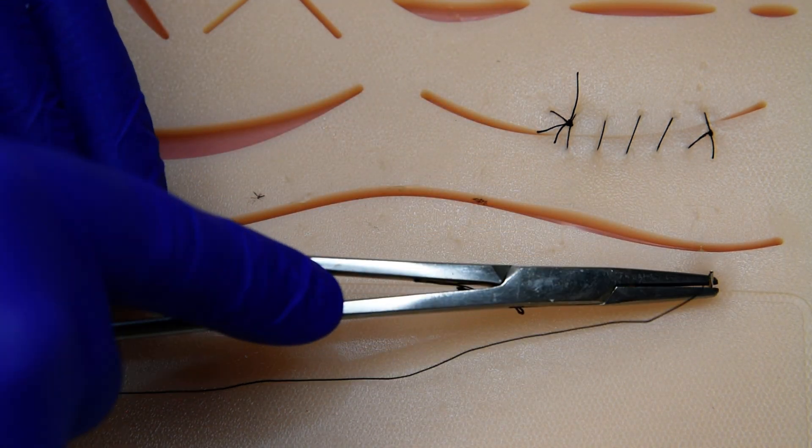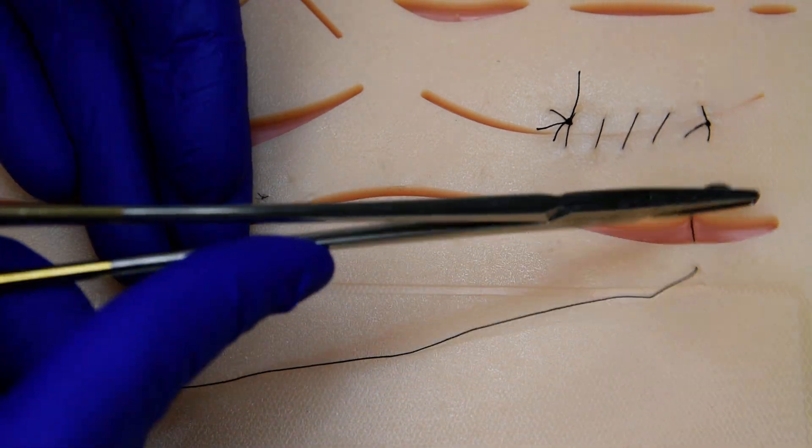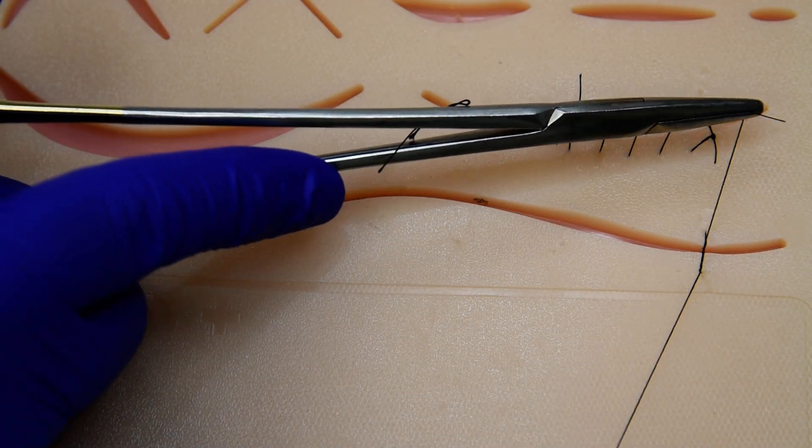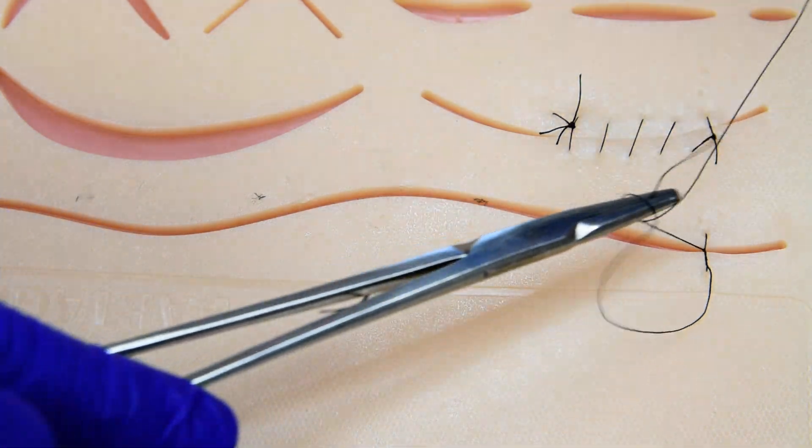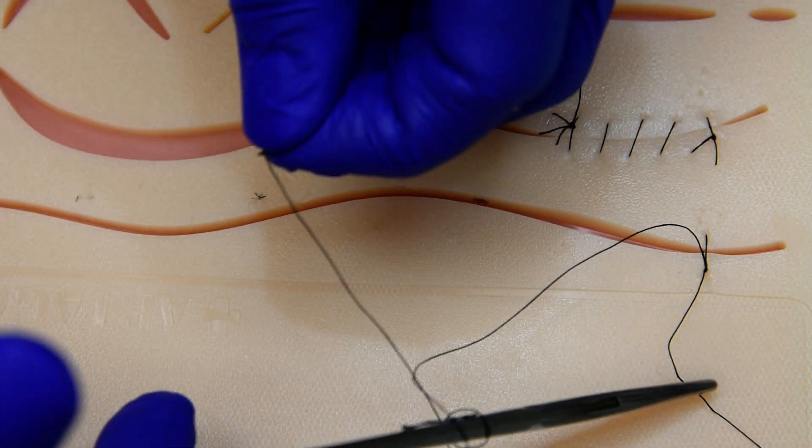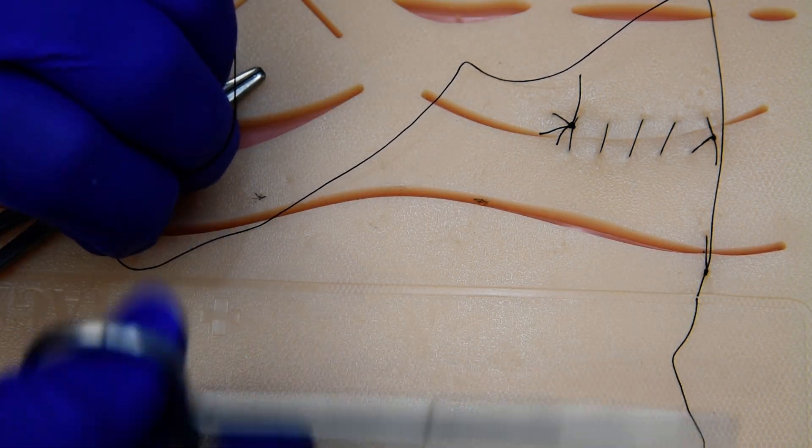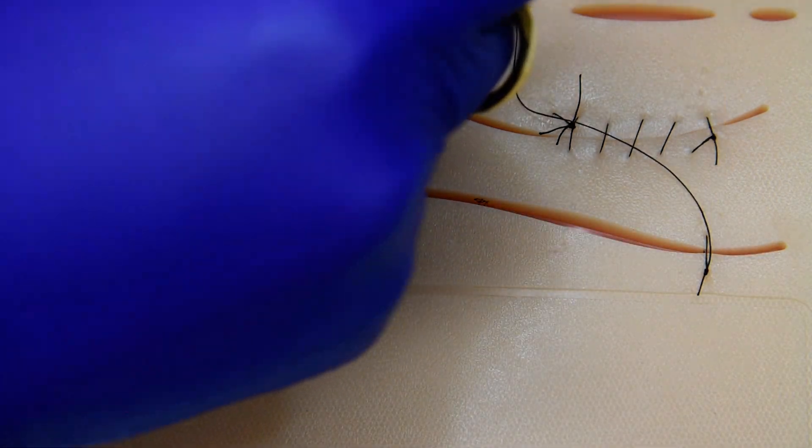We're going to start the same with a simple interrupted first for our interlocking continuous. So we'll tie our first knot, and then we can cut that tail and we're going to keep all of our knots on the same side.